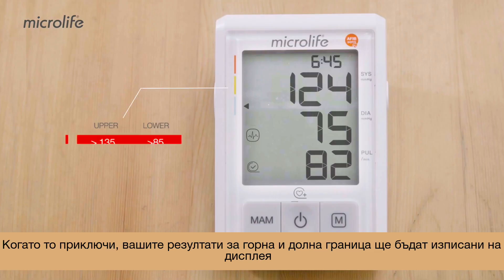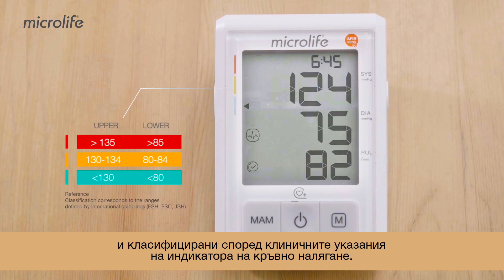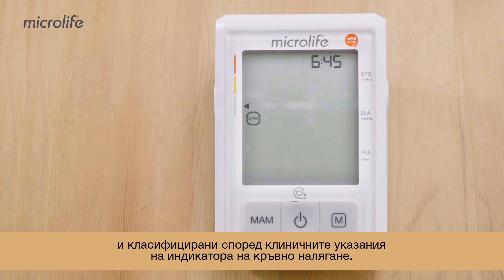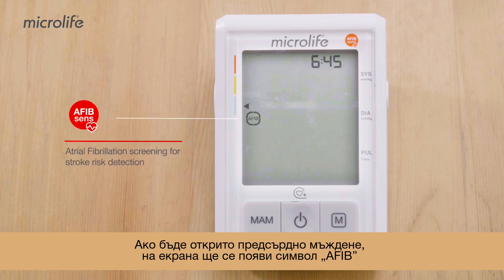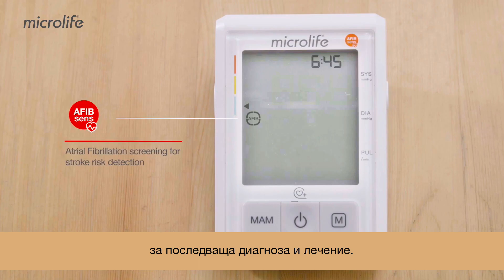When measurement is completed, your upper and lower pressure results will be displayed and classified using the clinical guidelines on the blood pressure level indicator. If atrial fibrillation is detected, an AFib symbol will be displayed. Please consult with your doctor for further diagnosis and treatment.